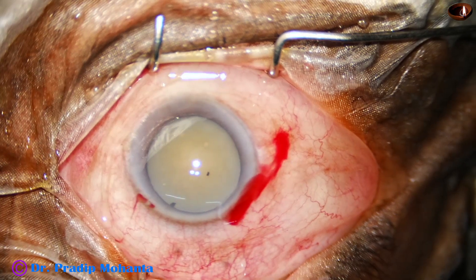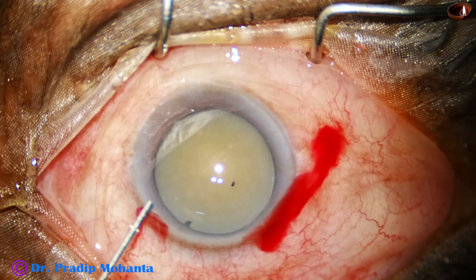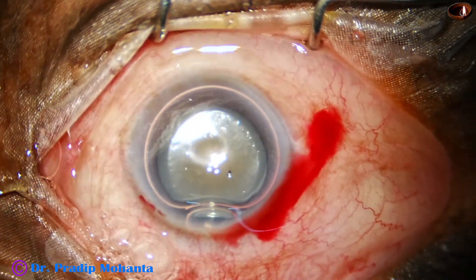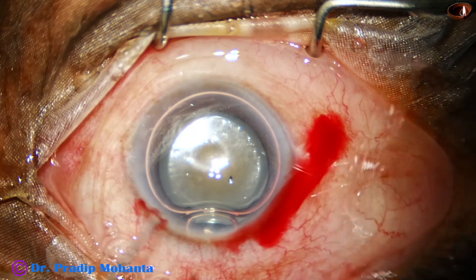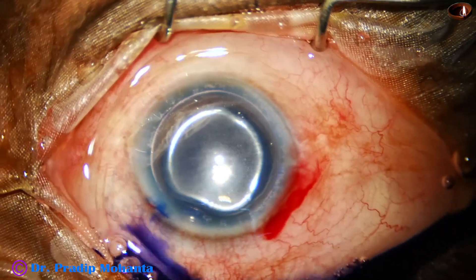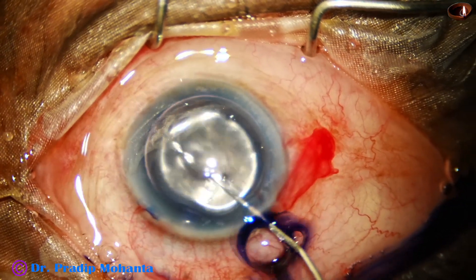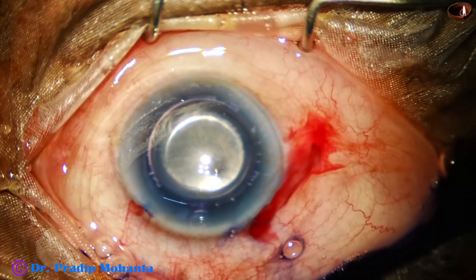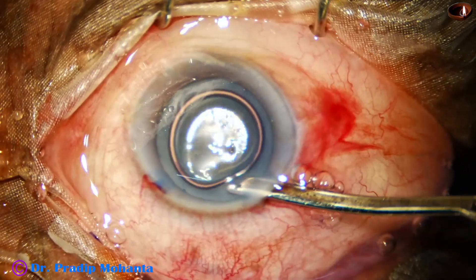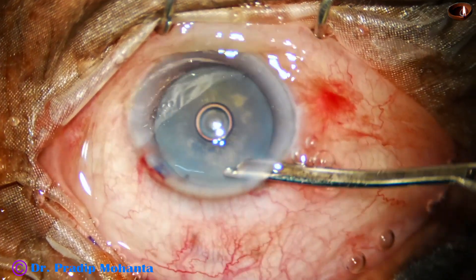The main incision and a side port has been made. Now an air bubble is injected into the anterior chamber. Trypan blue dye 0.06% is injected and it sits on the anterior capsule because there is no aqueous. Staining is good in a short time, maybe 10 to 15 seconds. This is real-time washing out of the dye.